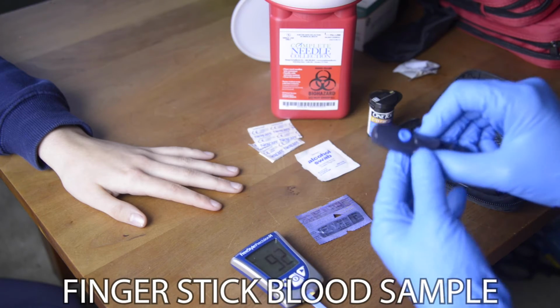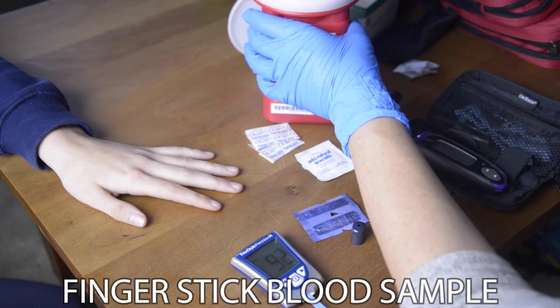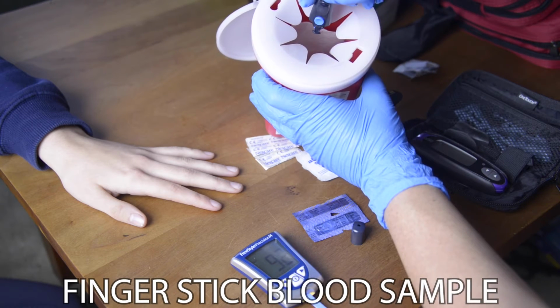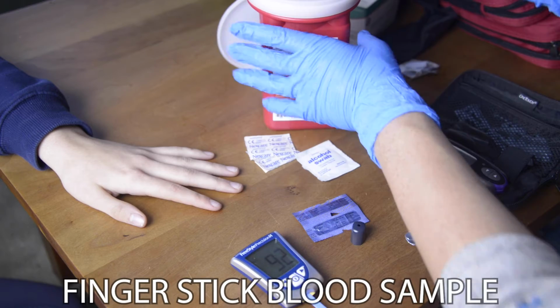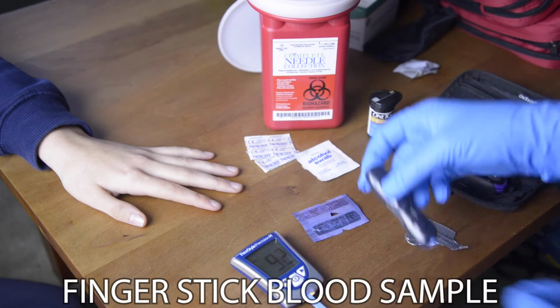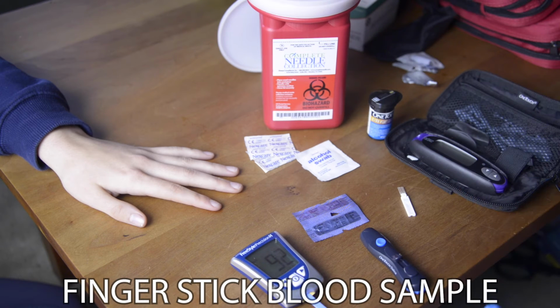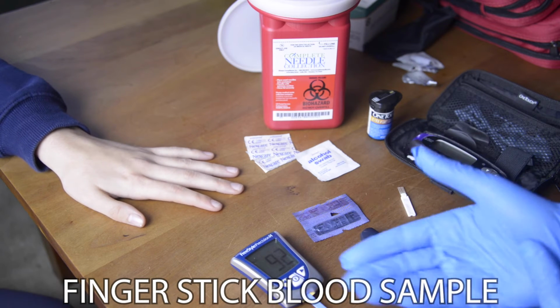Now you want to make sure that you dispose of your sharps properly. All of these lancets will work differently. And continue from there.